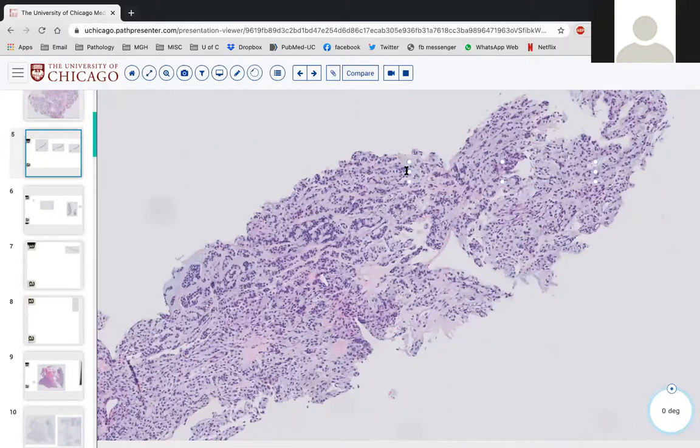That's probably not correct. Right, so maybe you're thinking about the breast. Yeah, I think I am. Adenomyoepithelioma. What is that in salivary gland? Is that a salivary ductal carcinoma, or intraductal carcinoma? But that's not what this is. Yeah, PA basically. Never mind.